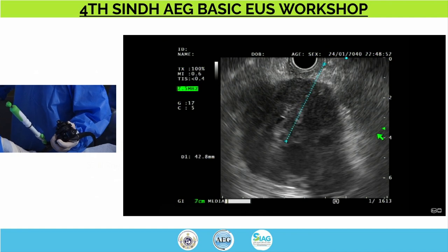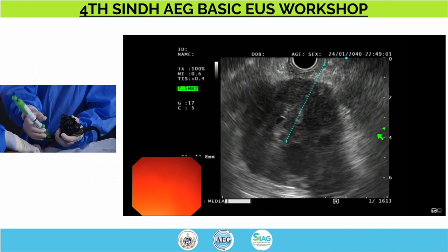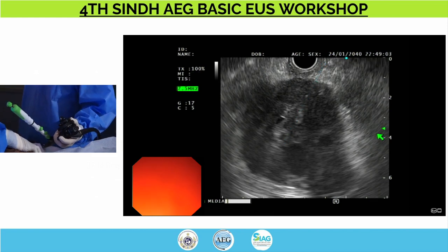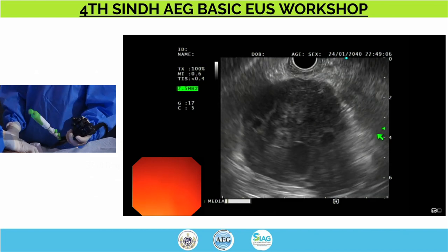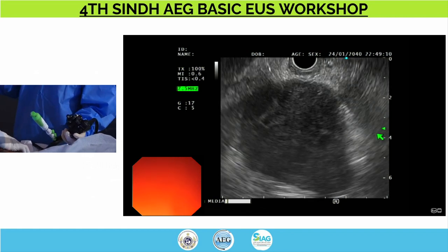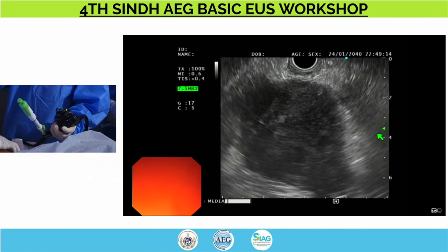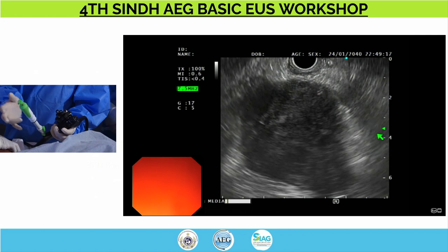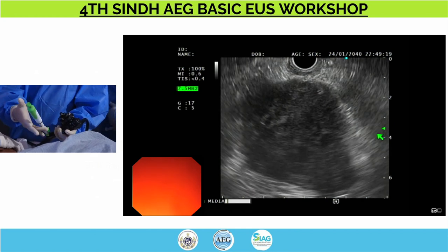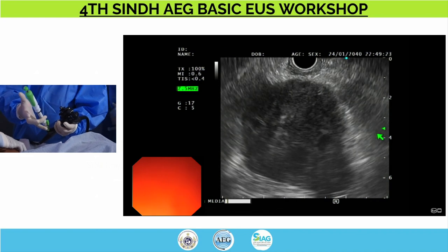And if I were to get down into the middle of this somewhere, I would need at least 4 or 5. So one way of playing it safe is to move to about 4 centimeters and lock your needle. Like Dr. Hassan will point out, that is not a foolproof mechanism, and it doesn't always translate to linear length. The other way to do that is to use your ring finger and place your ring finger roughly on the distance of the plunger that you think is a safe distance.